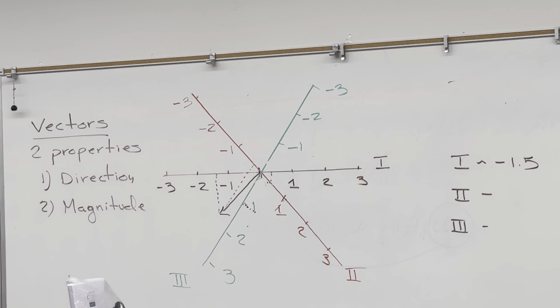And then to do lead 3, you're going to leave your red electrode here. You're going to pop off the black electrode, which was here, and put it over here on the left arm. And then the ground goes to the right arm. That's lead 3.